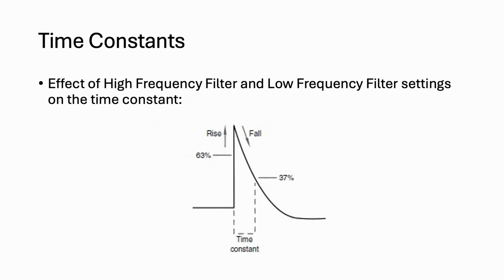How quickly the signal falls back to the baseline is determined by a filter's time constant. When a DC voltage is input, the signal at the filter output is changing almost immediately. After the signal reaches the peak, it immediately starts to decay back to the baseline, but slower.